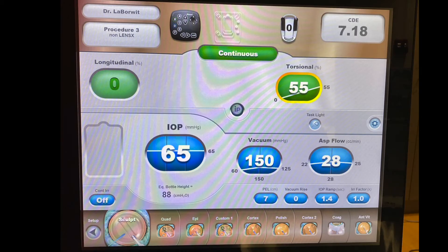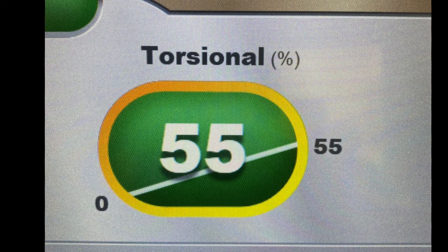Understanding the details of your FACO settings is critical. This is a picture of the sculpt mode on the machine—there's very low vacuum but high aspiration, and there are different settings for how to build your FACO. Zooming in on the torsional component, that diagonal line shows that as I'm in position two on the foot pedal, it increases the amount of FACO energy delivered.